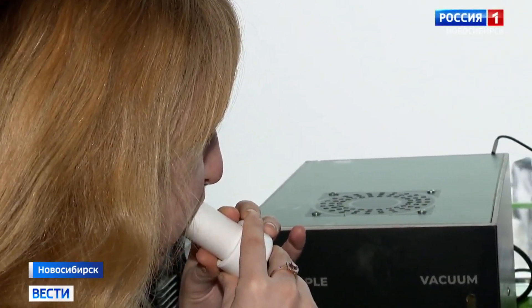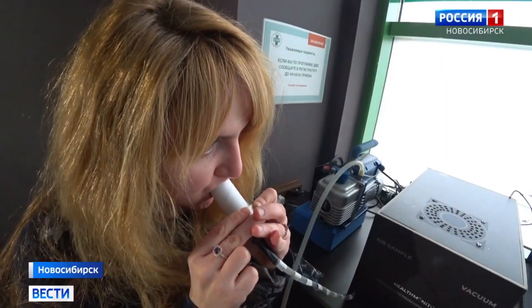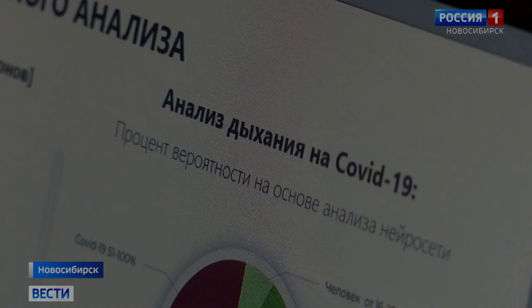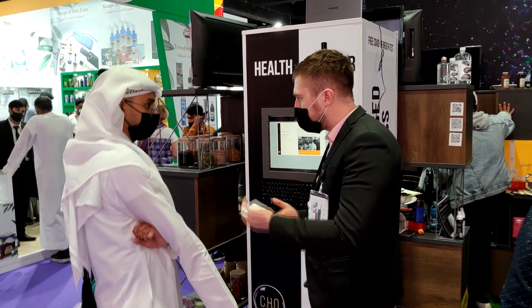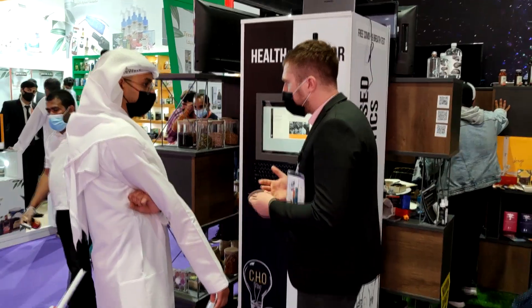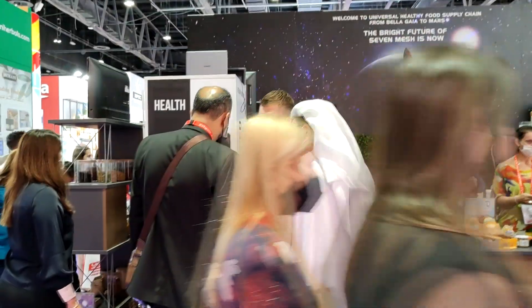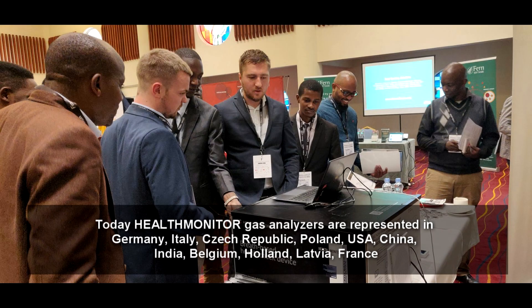The exhalation of a person is a complex air mixture of 750 volatile compounds. Gas levels are changing in sick people. So, for example, it's been proven that patients with diabetes release a large amount of acetone. The COVID-infected patient has other markers — high levels of ethylbutanate and isopropanol.